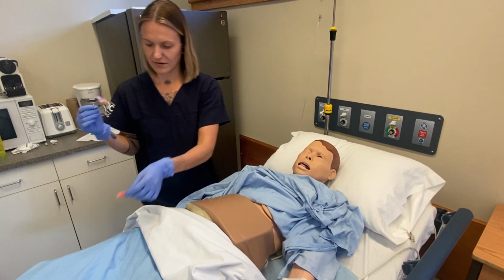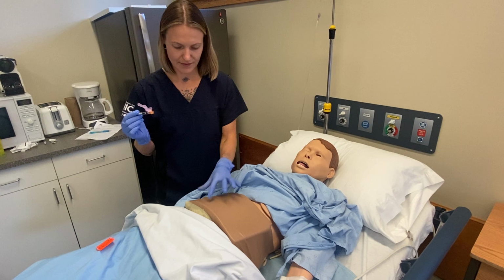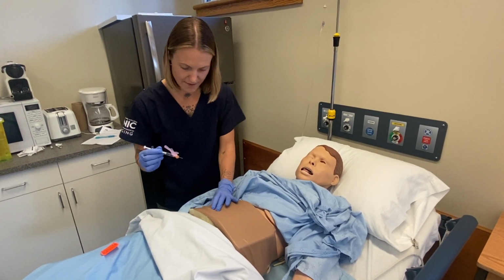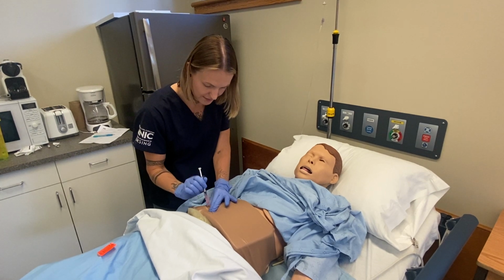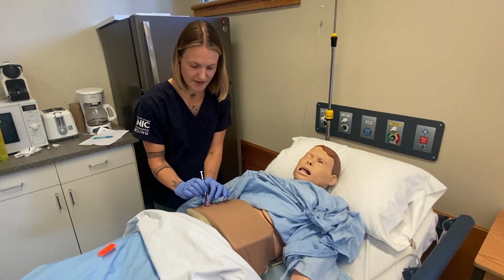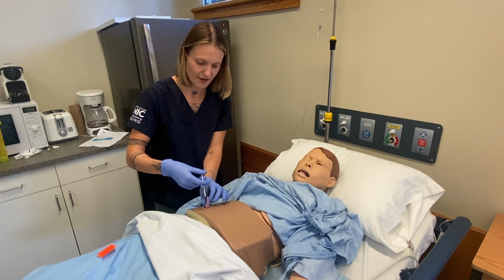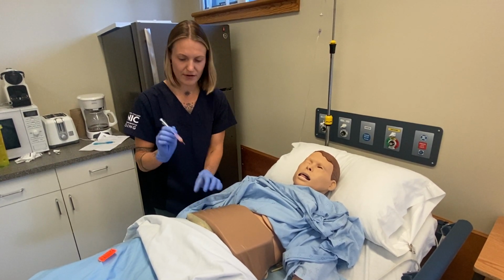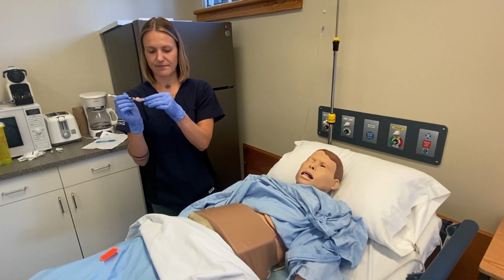So I will take that off, find my location, and then I will pinch the skin, and at 90 degrees, go in, and then I'll stabilize it with the other hand, push it in, and then pull it out and lock it.